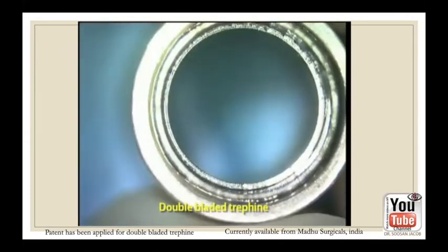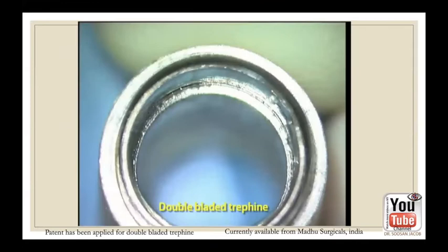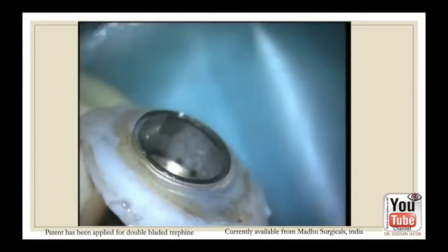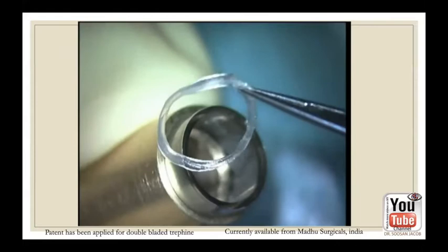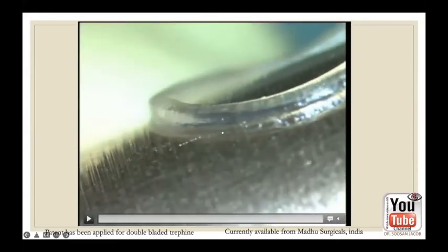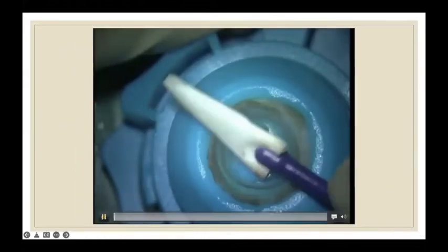So this is the double-bladed trephine with which I am able to make these rings, and this is patent pending, and in fact, it's just been allowed. Here are the two blades that you see, which are concentric to each other, which gives you this rim of donor stroma.